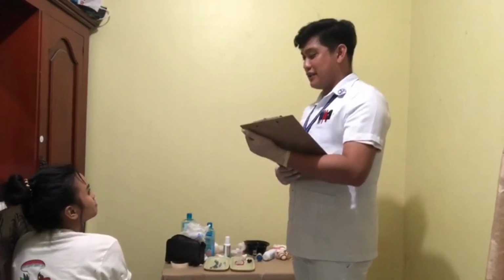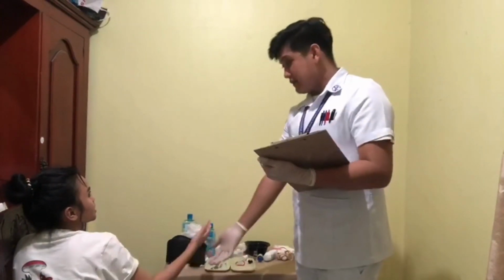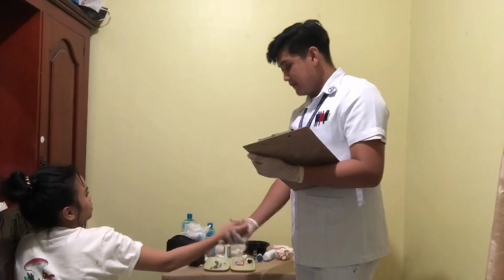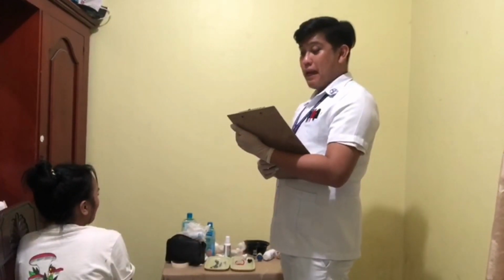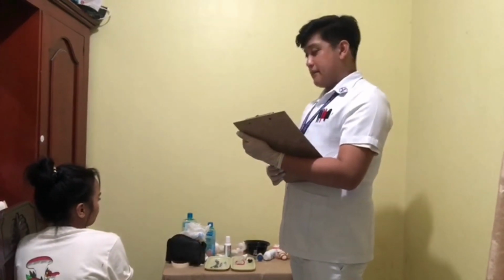So good day, ma'am. My name is Charles Asalesta, your student nurse for today. So may I know your name and your age, please? Christine, born July 14, 2002. Okay, thank you. So, ma'am, at this moment we are going to administer a medication via the intramuscular route.